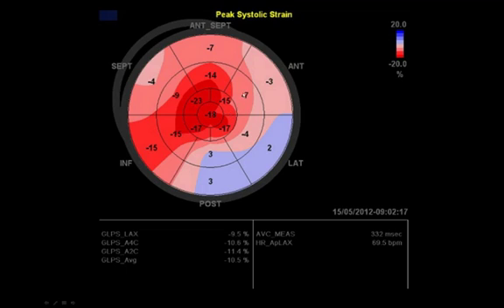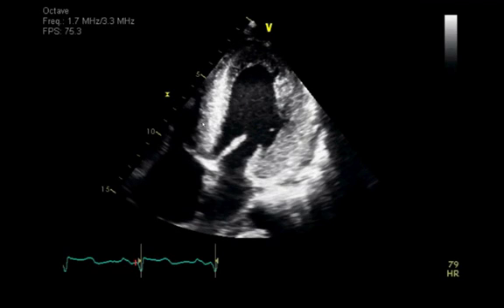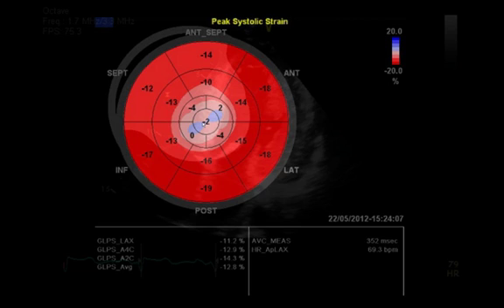They would basically be tan all over, and it's amyloid that accumulates these proteins and this junk that interferes with cardiac function. But there's some apical sparing, and that has very recently been published, I think, in JACC from the Cleveland group. And then we have the other pathologies where it helps, like this one.